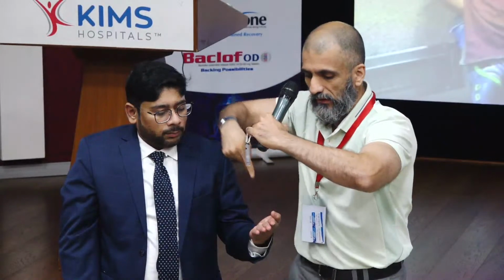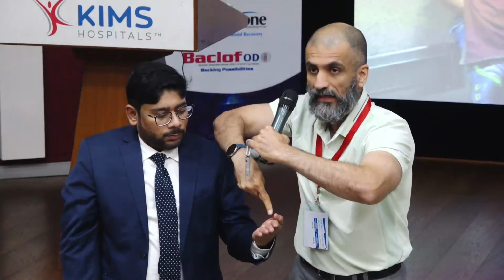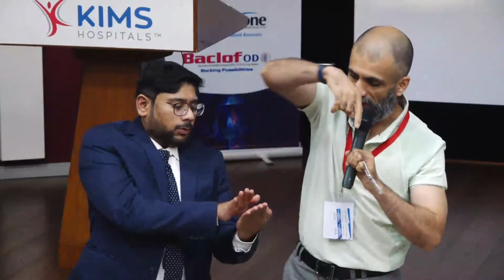So if we place the C-arm on the same side, you will be able to see the joint but won't be able to enter it. So imagine this is the direction; I will be putting the needle and won't be able to enter. That is what I do. We put the C-arm on the opposite side and align it, and then we are able to enter. So that is what he was trying to do.